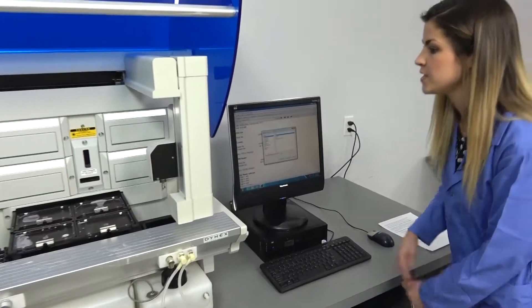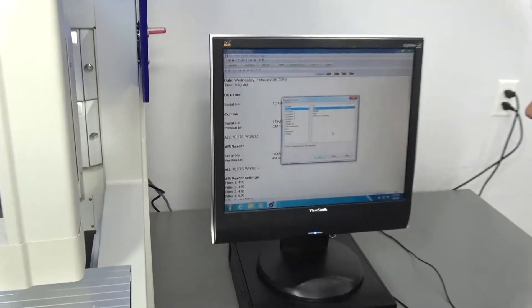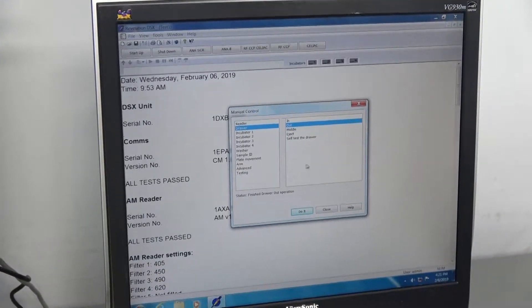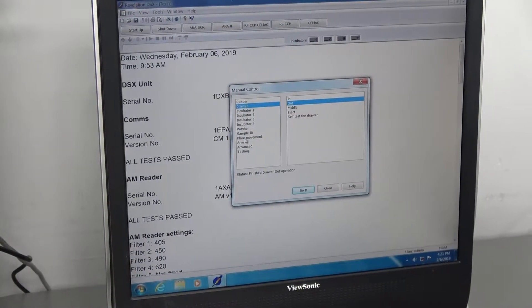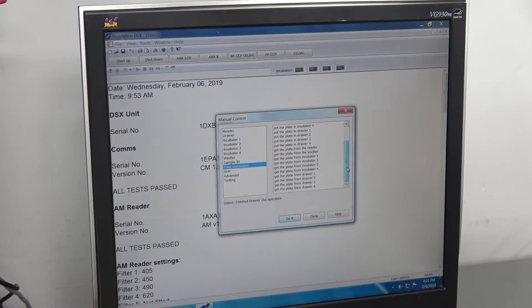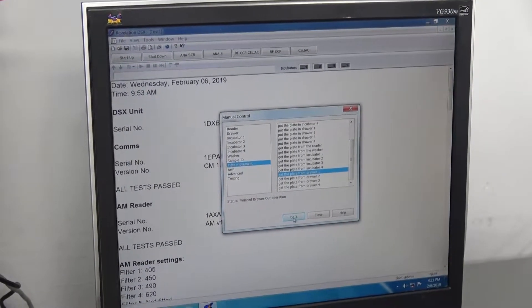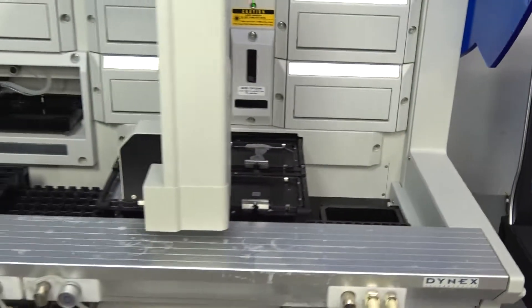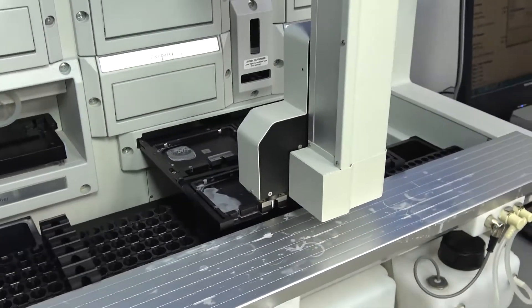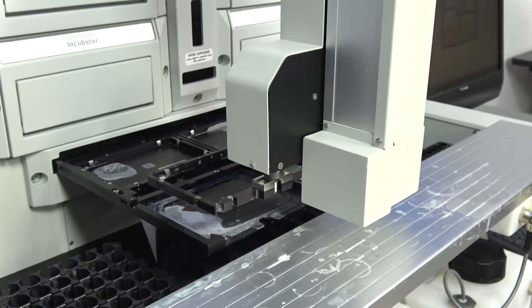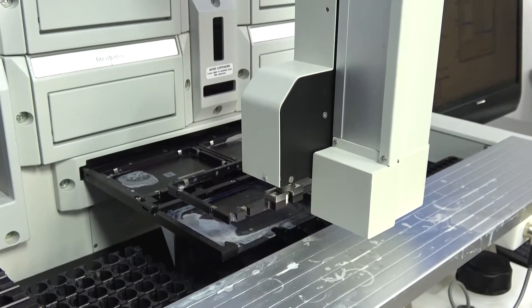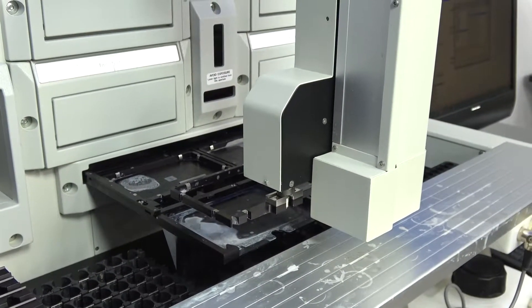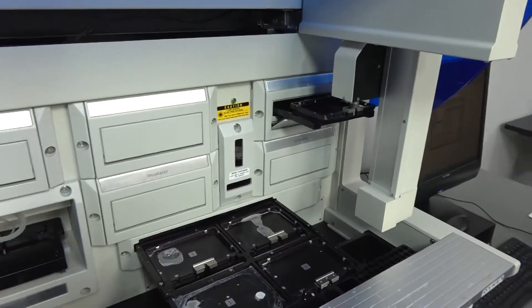So I will show you the operating system. This is Revelation, and it is installed on Windows 7 on the computer. So we will watch the robotic arm, which is going to pick up the plate from drawer one. And those are all labeled so that you can see. And we will put that in one of the incubators. You can see the arm has really nice fluid motion.